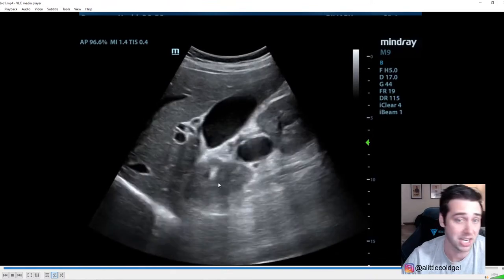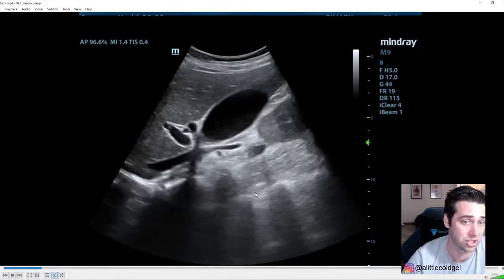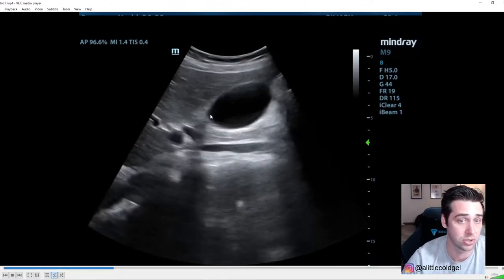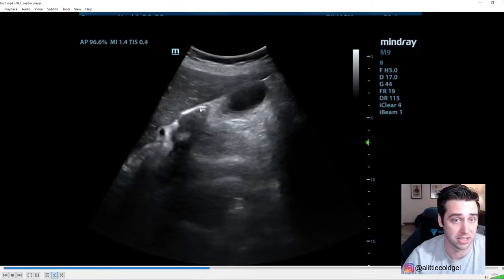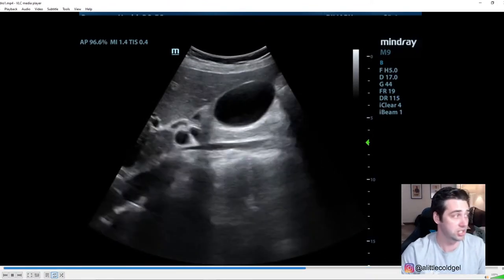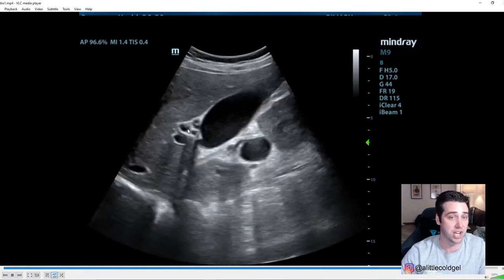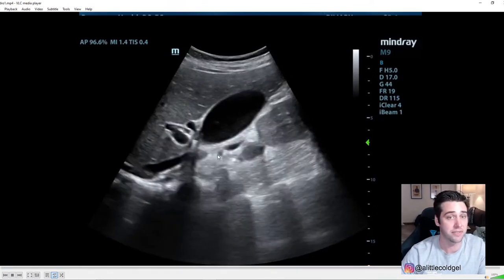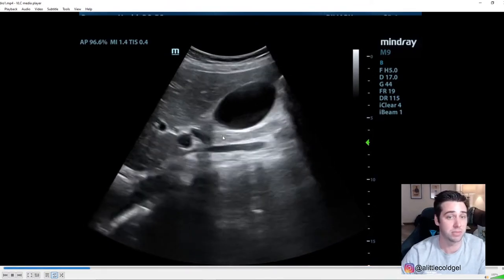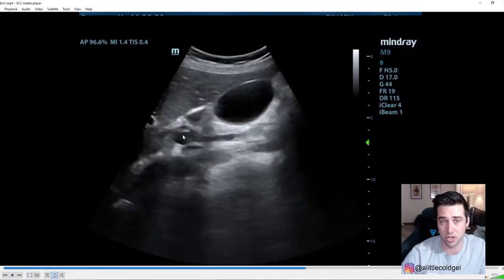Here's another gallbladder view — curvilinear probe, liver, and you can see a nice stone right there, another stone there, with a lot of shadowing. Get used to looking at the gallbladder and picking out stones — sometimes it's more subtle and you have to really watch for shadowing to identify them.